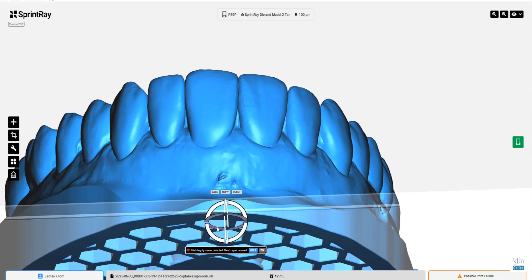This video is about working through a digital wax up where we're making just a few tweaks to optimize a biocopy model for CEREC with a new shape. These are minor shape changes where I don't use a full face. We'll go through the full workflow — the digital wax up, clear through the study models, and prepare that study model to print. Here's the secret: if you're going to biocopy a study model in CEREC, always scan it first into the biocopy catalog. If you scan it after you've scanned the preps, it won't scan the study model properly and will leave holes in it. The biocopy works extremely well from a digital wax up when it's done accurately.